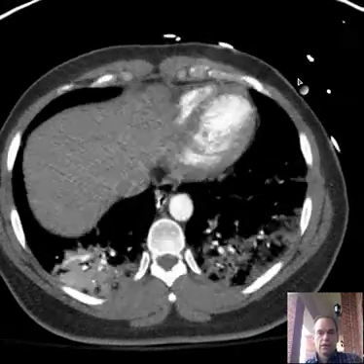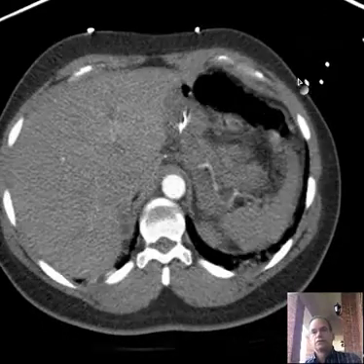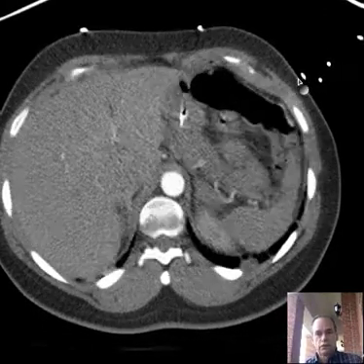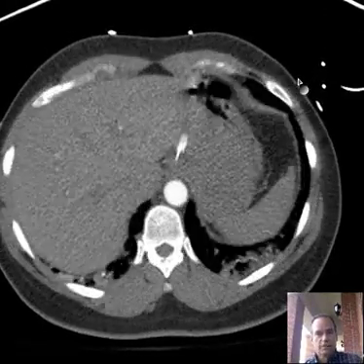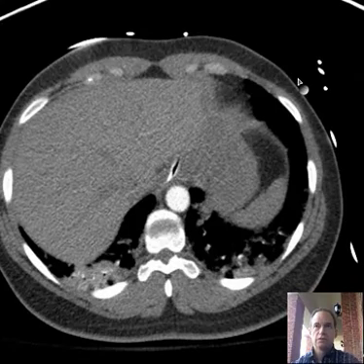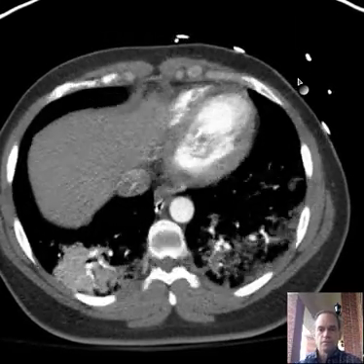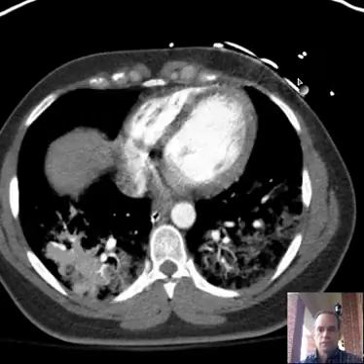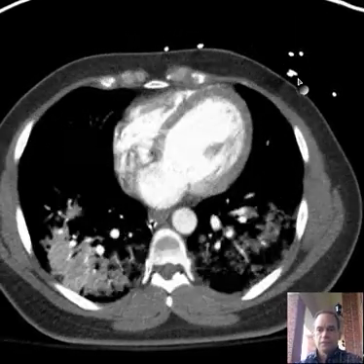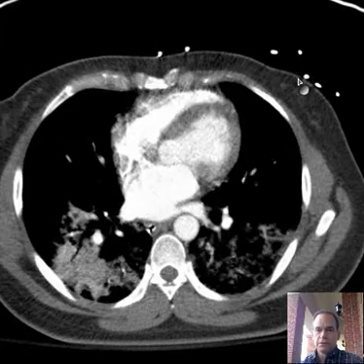This patient has shortness of breath and they ordered a CT pulmonary embolism protocol. Do you see pulmonary embolism?